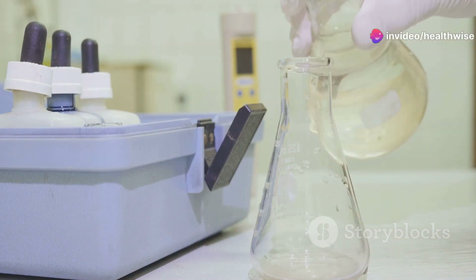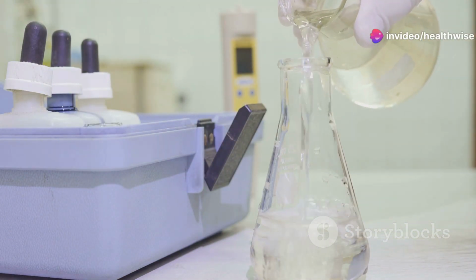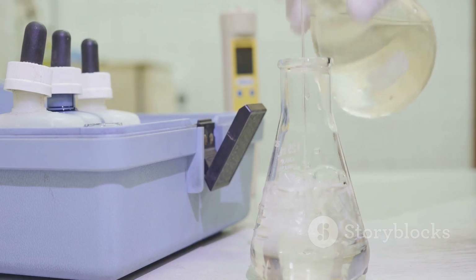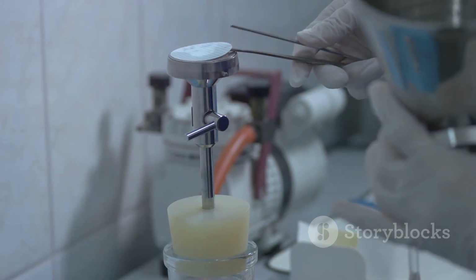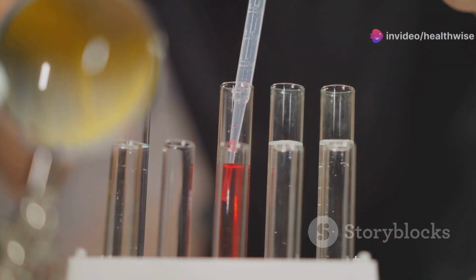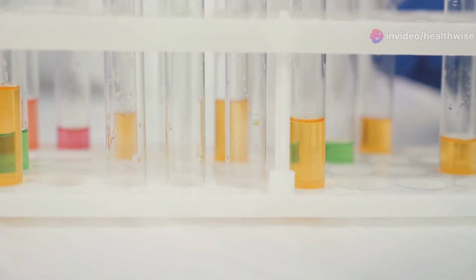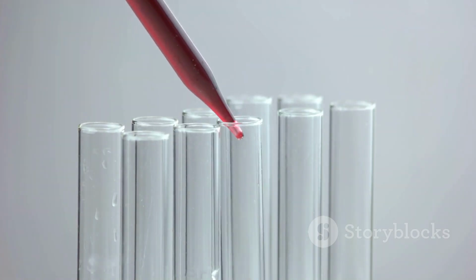Start by diluting your filtered urine sample with distilled water until its specific gravity is between 1.006 and 1.008. Make sure to note the amount of water you used. If the urine is alkaline, switch the reaction to acidic with 2 drops of 22% acetic acid. Now fill the Esbach's tube to the U mark with your diluted urine. Add Esbach's reagent up to the R mark.